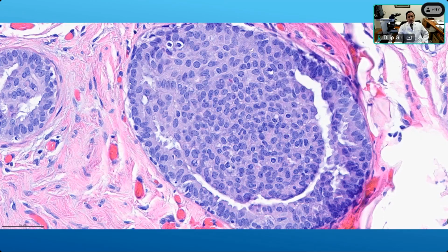Okay, so anyway, you are right that this focus represents UDH or usual ductal hyperplasia. In Europe and United Kingdom, these kind of changes are also described as epitheliosis. So here what we see is a duct that is filled with cellular proliferation. These cells are haphazard, right? There is some overlapping, the spacing is not uniform, the cells pretty much are not respecting one another.